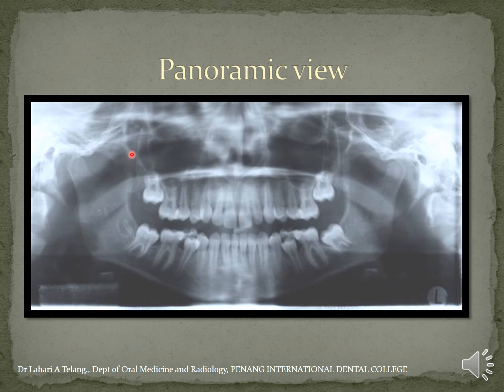So this is used as a scout film or also as a guide film before you want to, let's say, do a third molar surgery, or you want to place an implant, or you just want to start orthodontics, and it's a very important radiograph. Or of course, if there is trauma and you're suspecting fractures.